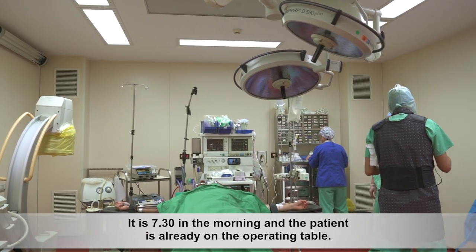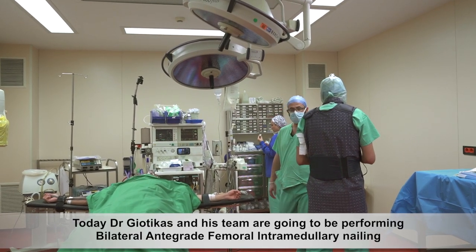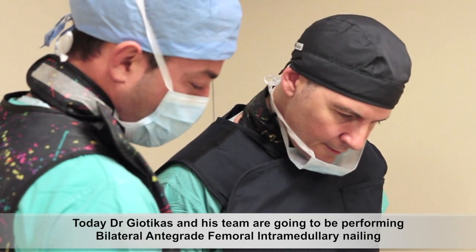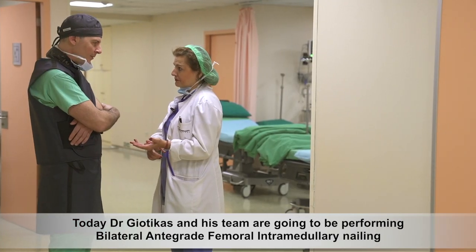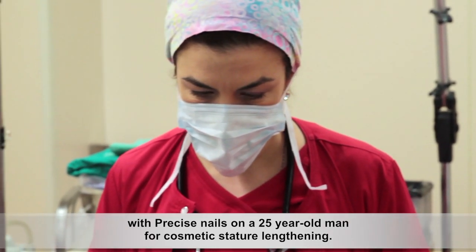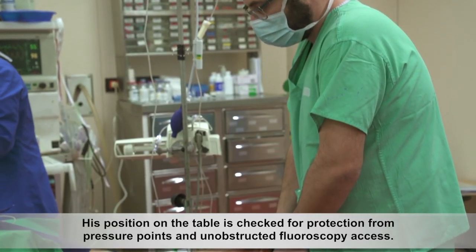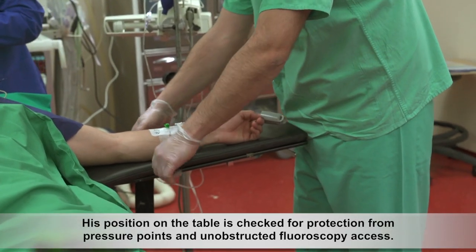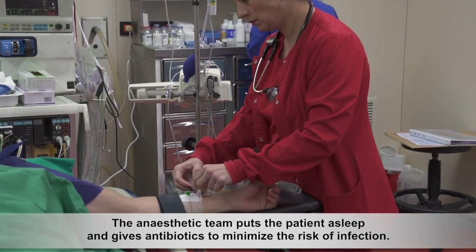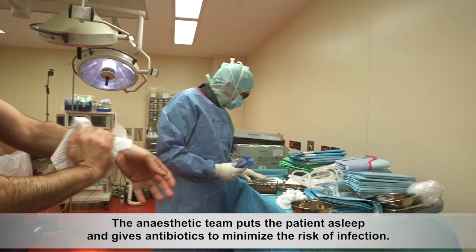It is 7:30 in the morning and the patient is already on the operating table. Today, Dr. Giotikas and his team are going to be performing bilateral antegrade femoral intramedullary nailing with Precice nails on a 25-year-old man for cosmetic stature lengthening. The theatre staff is preparing the patient. His position on the table is checked for protection from pressure points and unobstructed fluoroscopy access. The anaesthetic team puts the patient to sleep and gives antibiotics to minimize the risk of infection.